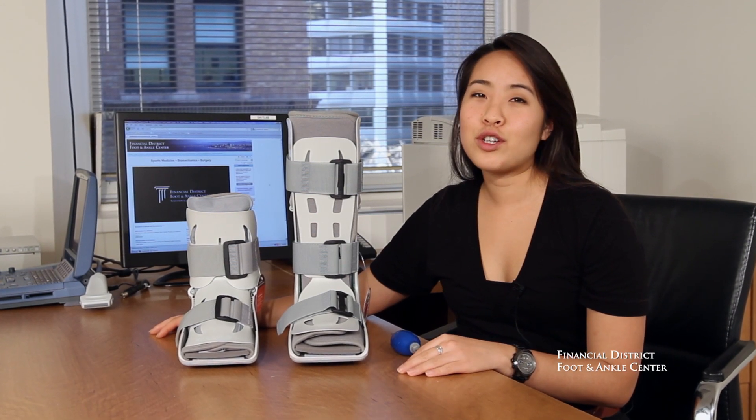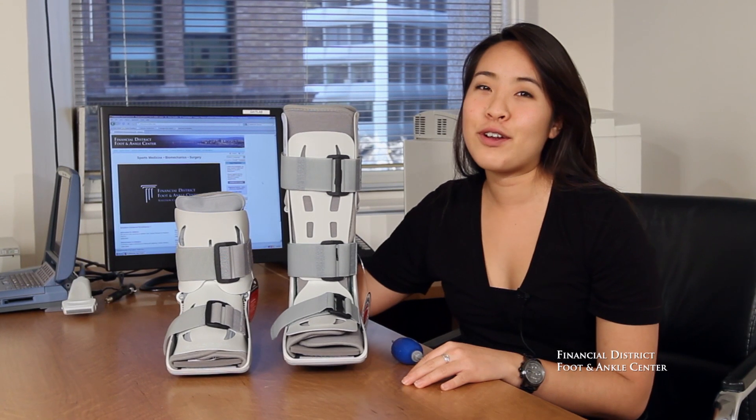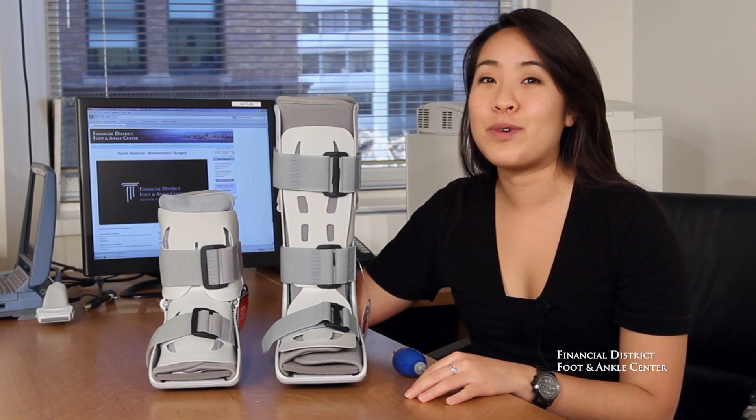Depending on your injury, the doctor will determine which length air cast is appropriate for you. Here at FDFAC, it's our goal to get you back to action as fast as possible, and the air cast will help us do that.